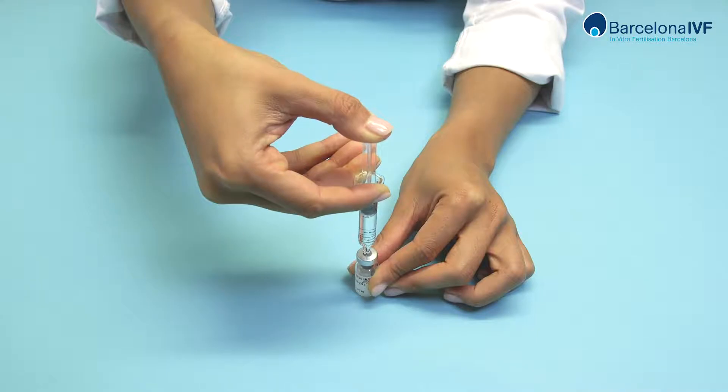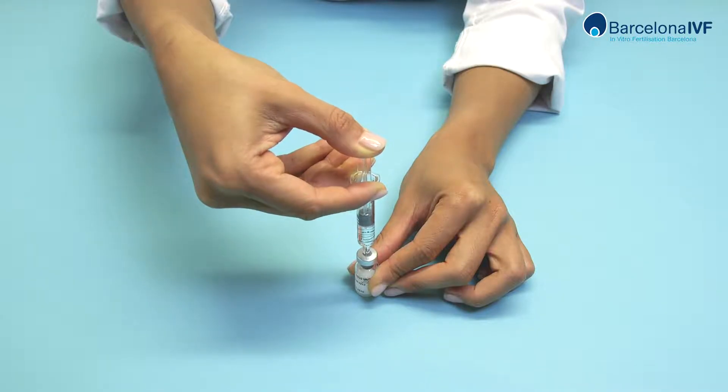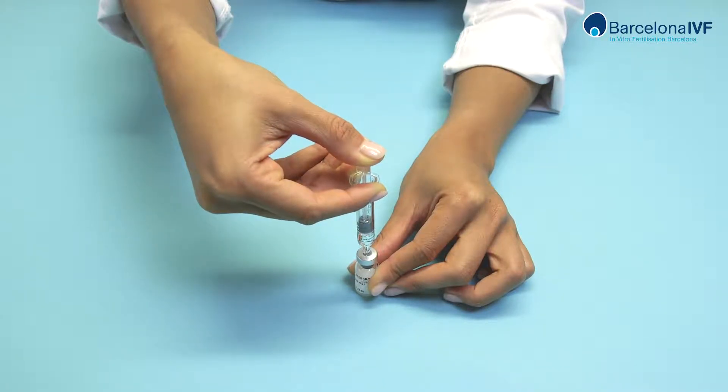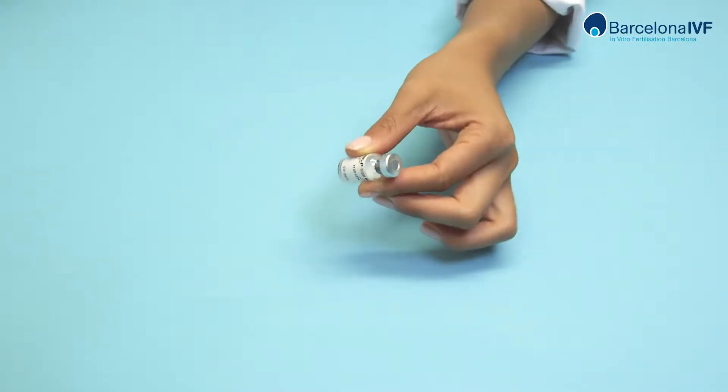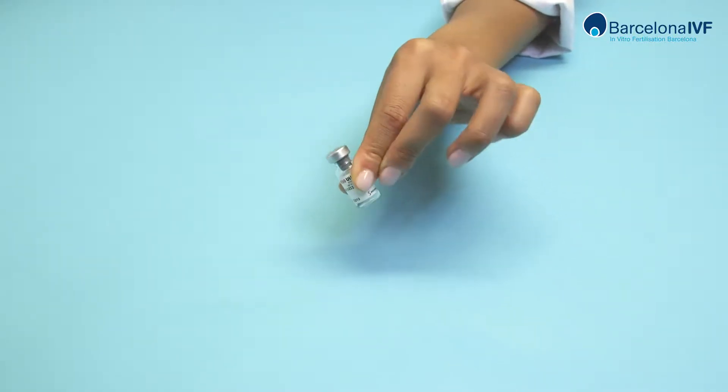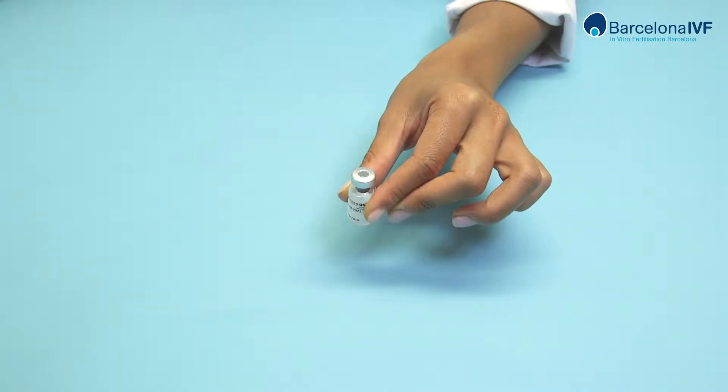Move the plunger until its limit so all the liquid is absorbed. Do this slowly to avoid foam being formed. Remove the syringe and place it in a specialized container. Shake the vial gently and let it settle for a few seconds.